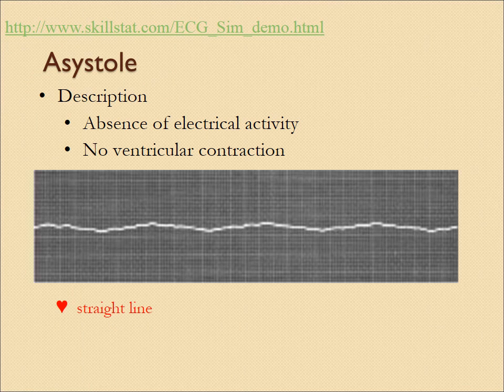And finally, we're going to look at asystole. Going back, I'm sorry, on your VF, we are going to defibrillate that. We want to get rid of that chaotic rhythm. We're going to shock it and hope that a good rhythm comes back.